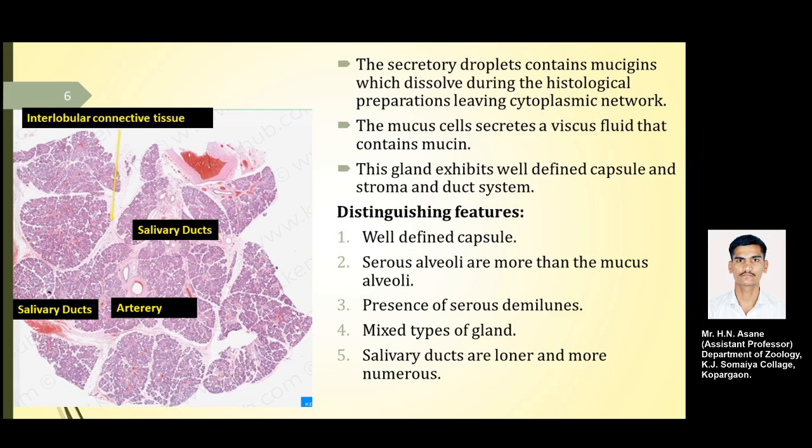As you can see in this TS, this is the TS of the submandibular gland, stained by the hematoxylin and eosin stain at medium magnification.